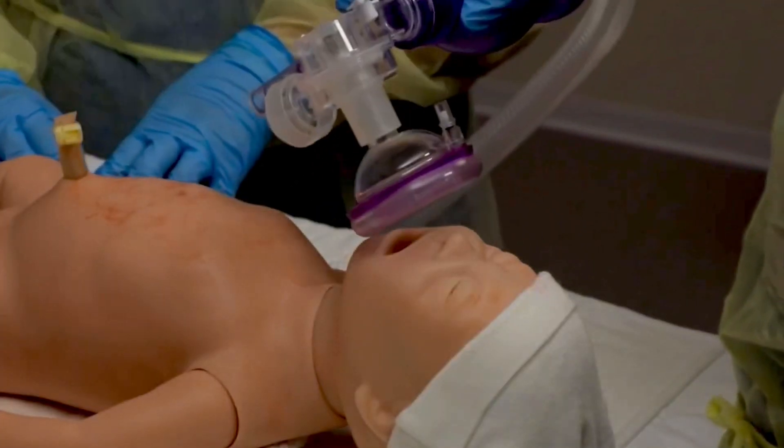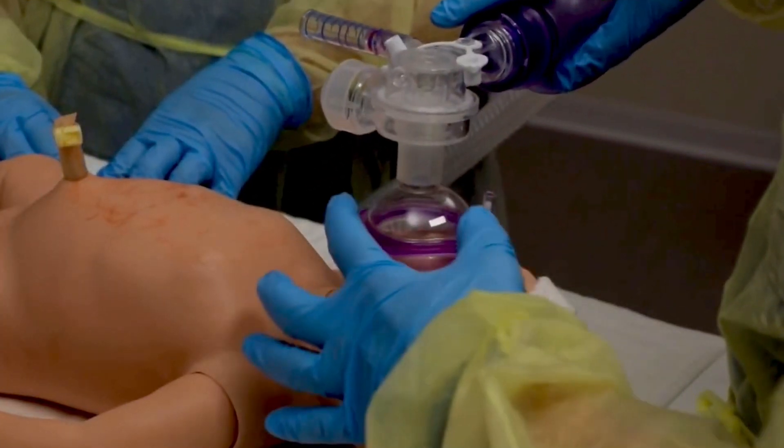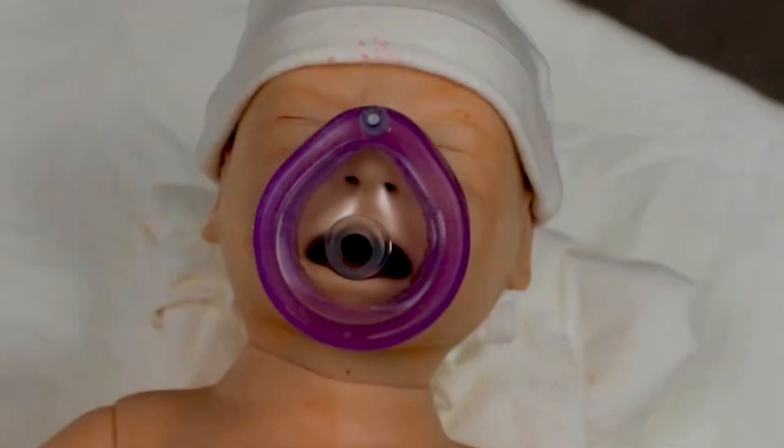PPV begins immediately, within the first 60 seconds after birth. During your equipment check, you anticipated the correct size mask and prepared the PPV device for use.